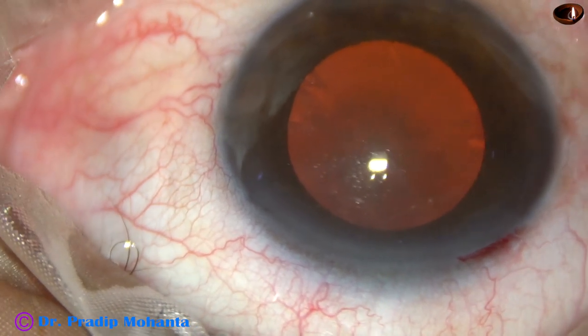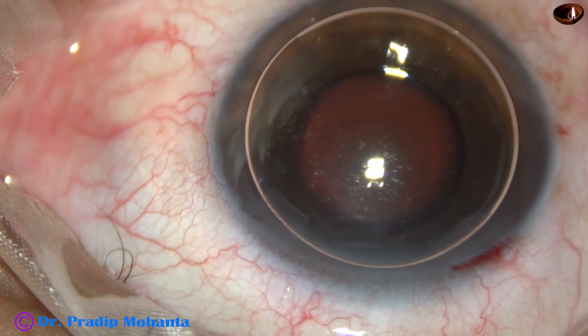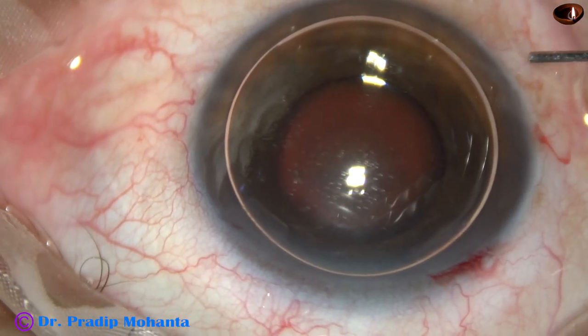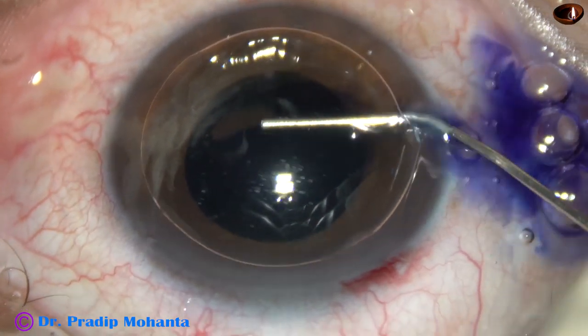Now I want to stain the anterior capsule with trypan blue dye, and I usually do that underneath an air bubble. This is the trypan blue dye.